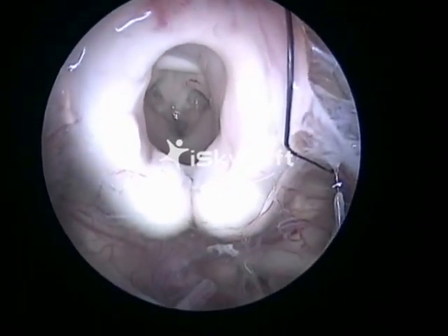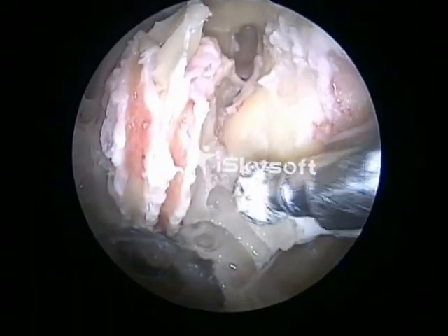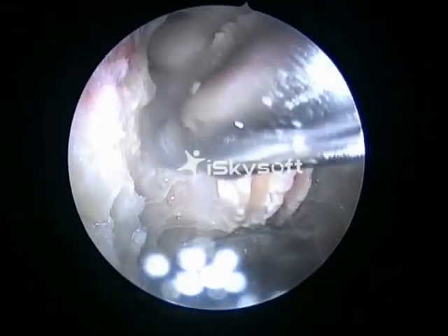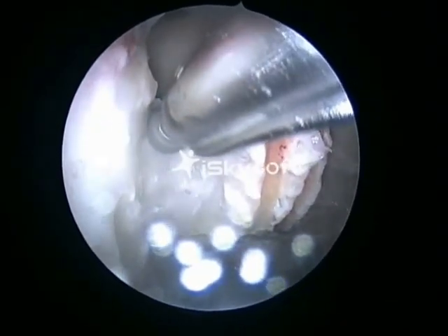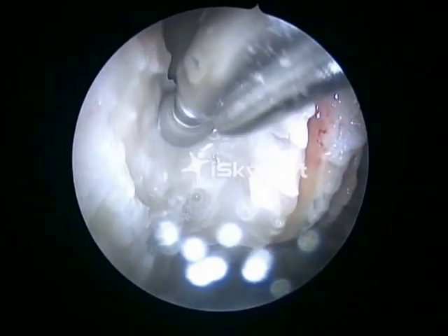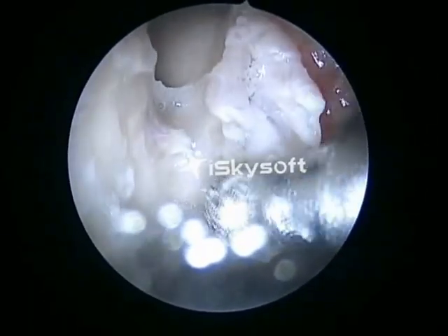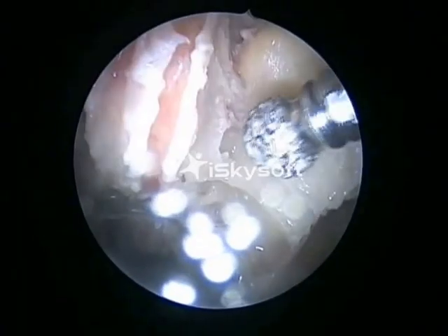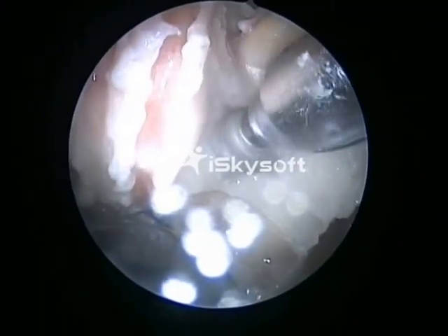The next exercise would be a transcribriform approach, the anterior craniofacial resection. The first step would be to delineate the anterior and the posterior ethmoidal artery on both sides. For this, we drill the canal of the anterior ethmoidal artery on both sides, and in a live situation, we cauterize it at the point of its entry into the intracranial cavity.